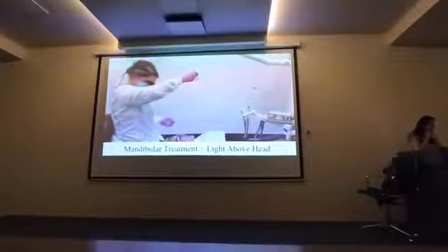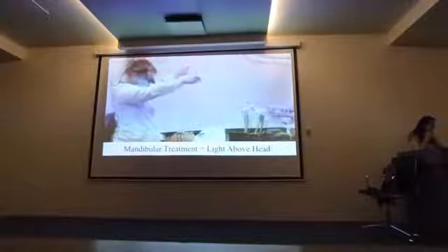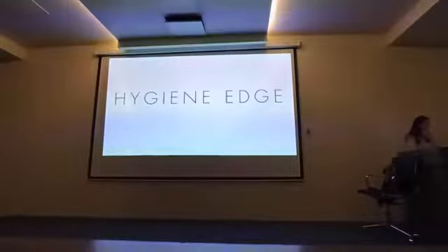To position the light for the mandible, keep it within arm's reach at a range that is perpendicular to the floor or slightly above the patient's head. And for the maxillary arch, position it perpendicular to the floor or slightly below the patient's head.